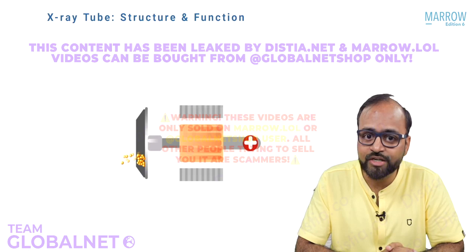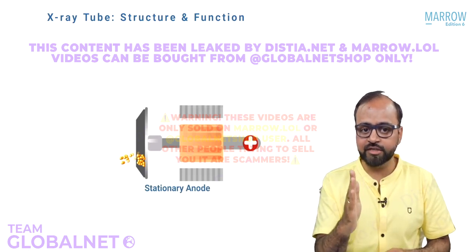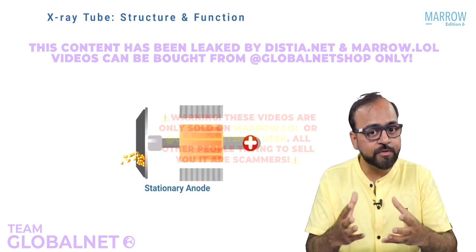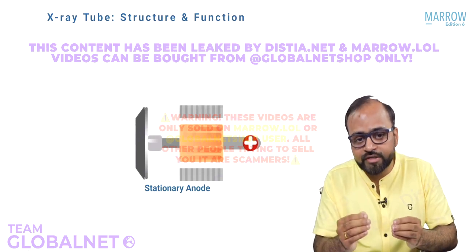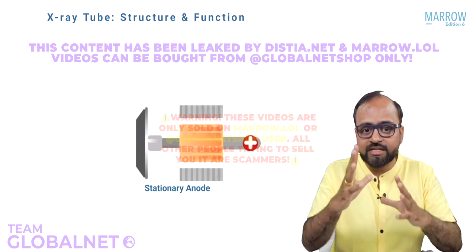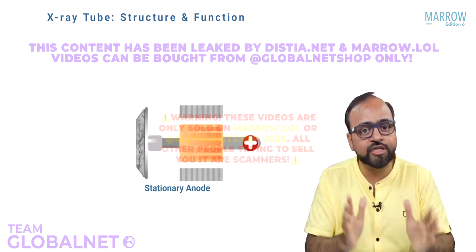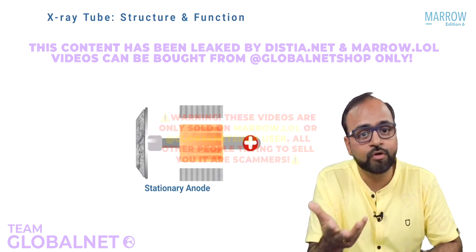Now in olden X-ray tubes, the anode was a stationary anode. So it was just like a metal sheet. It was hit by a high velocity stream of electrons. A lot of heat was produced. When metal is heated, it expands. When it cools down, it retracts. So this expansion and retraction gives rise to a very irregular shape of the anode. So it had to be replaced, right? It did not have a long life.